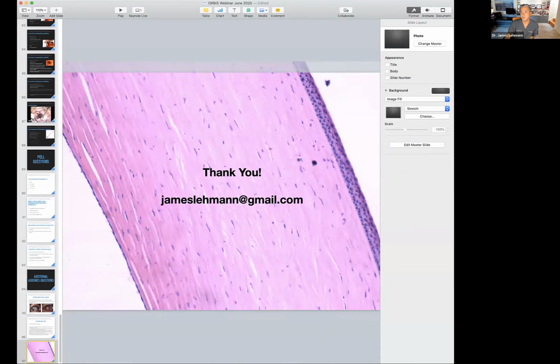Man, there are a lot of questions. Okay, so Dr. Justin Prashanth asks, in keratoconus, do you still prefer a donor cornea 0.25 larger? Yeah, I do. I don't like 0.5. I mean, but some surgeons do. It's a choice. You have to do it, and then you kind of see which works better for you.